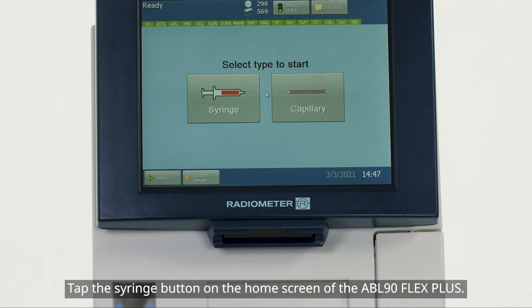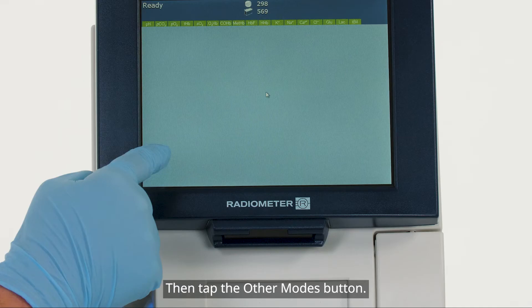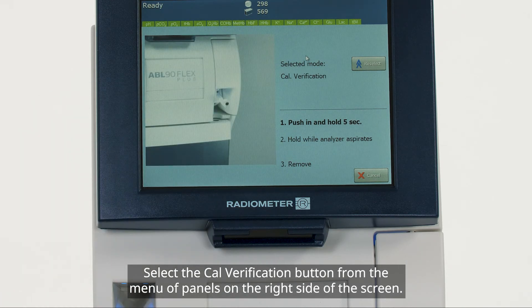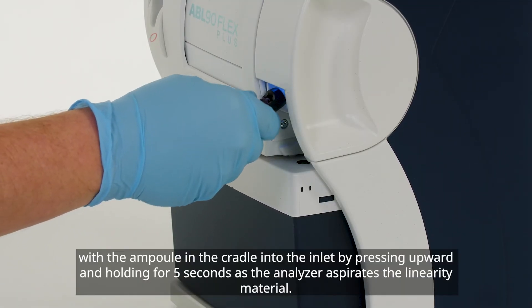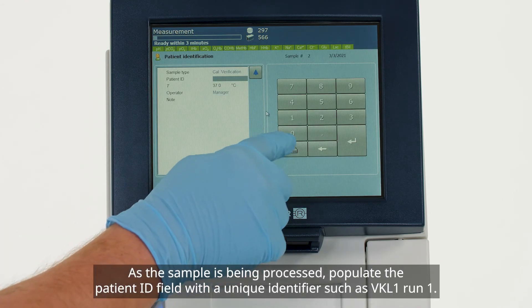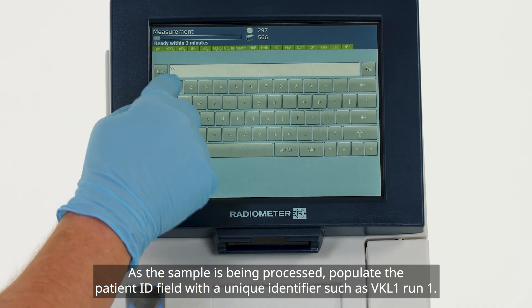Tap the Syringe button on the home screen of the ABL-90 Flex Plus. The inlet will open. Then tap the Other Modes button. Select the Cal Verification button from the menu of panels on the right side of the screen. Insert the QualiCheck opener adapter with the ampoule in the cradle into the inlet by pressing upwards and holding for 5 seconds as the analyzer aspirates the linearity material. As the sample is being processed, populate the patient ID field with a unique identifier such as VKL1 Run1.